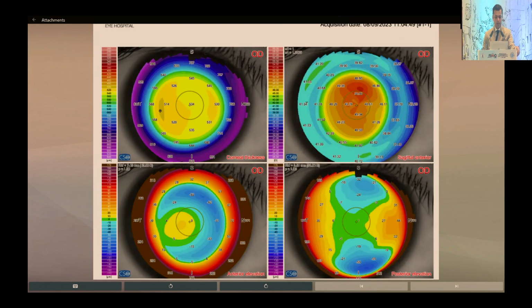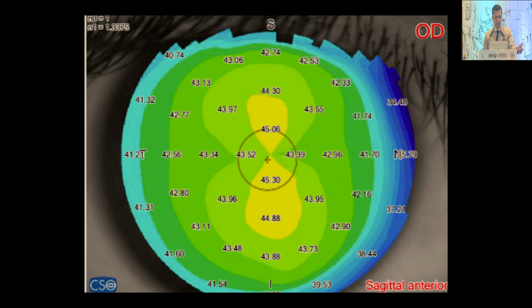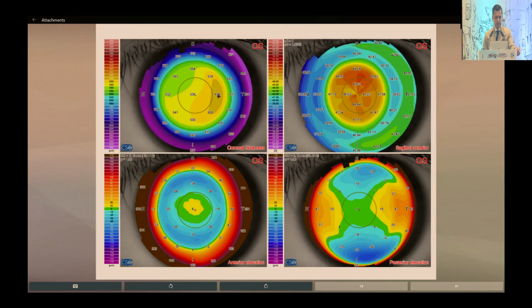Again, everything unremarkable. But notice, I did a contour on this patient and noticed post-operatively, you can see a bump over here. What essentially a hyperopic LASIK will do is take out a whole donut-shaped button from this area, so as to dissociate the central cornea from the peripheral cornea, and it will bump your central cornea so that it becomes like a lenticule in the center. So this is before and this is after, the same eye.